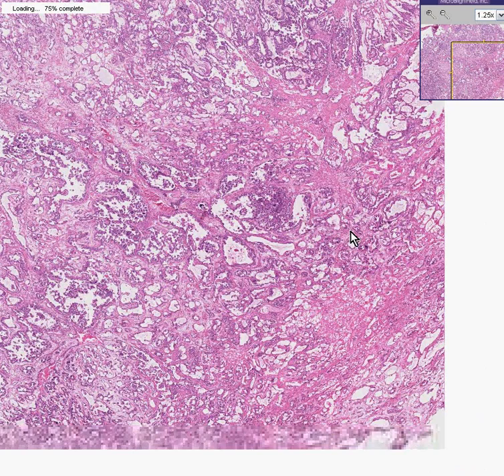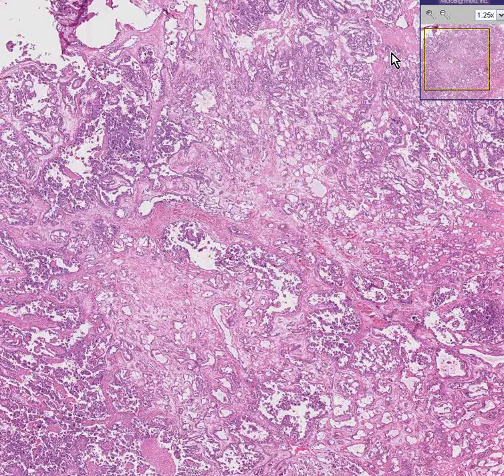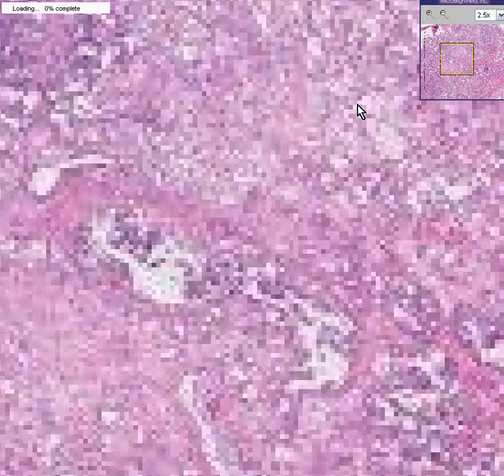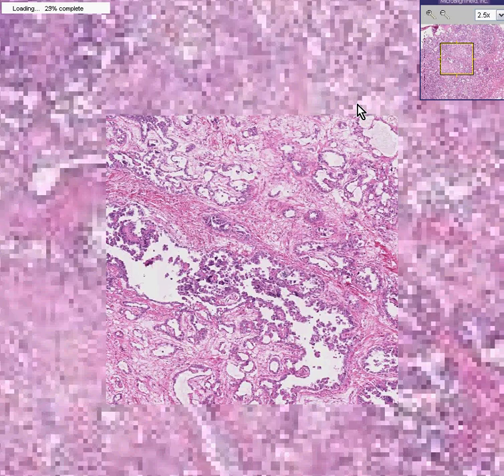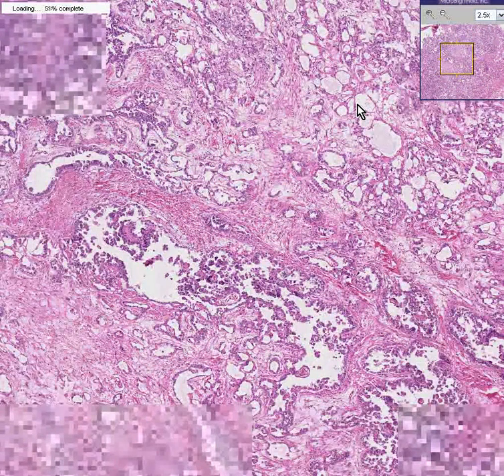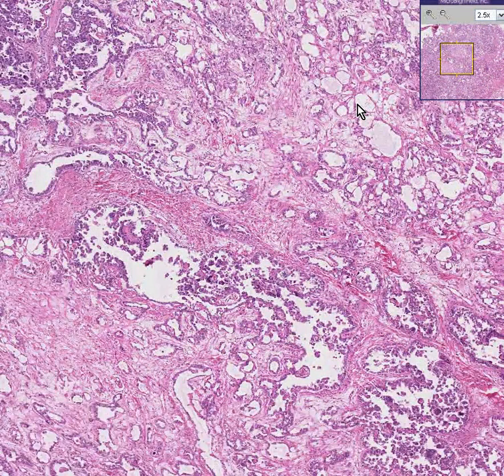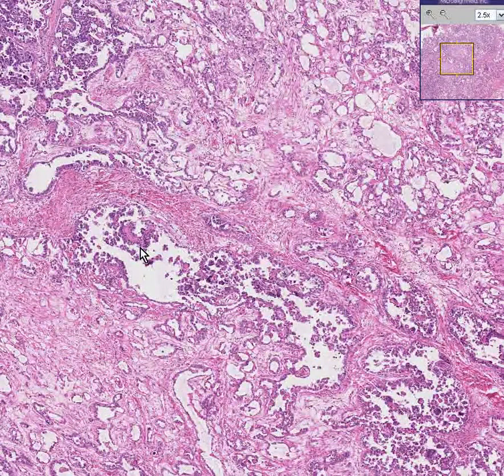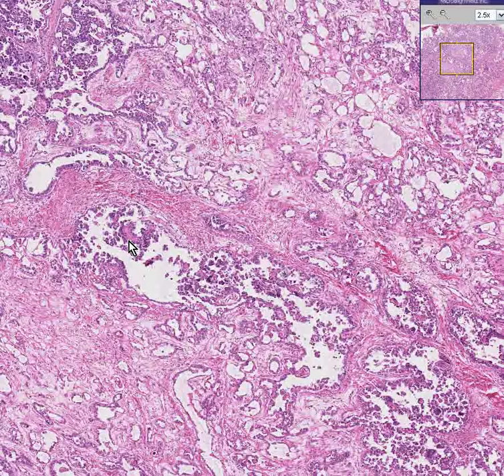What you see instead is something that looks very much like an adenocarcinoma. And I know what you're thinking: how can you have an adenocarcinoma of the testis, some of which looks almost papillary, if the testis normally doesn't have glands?